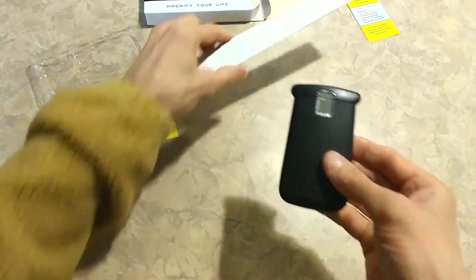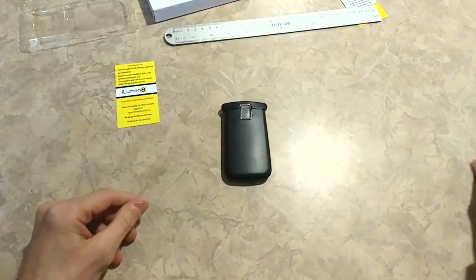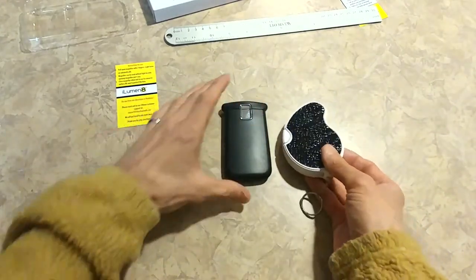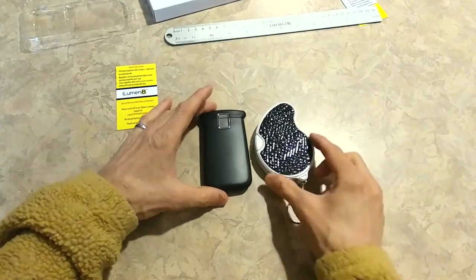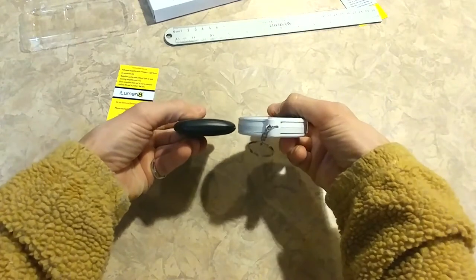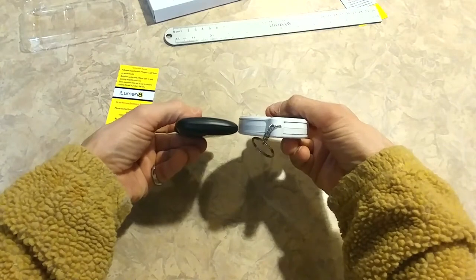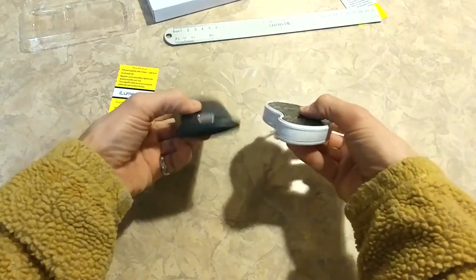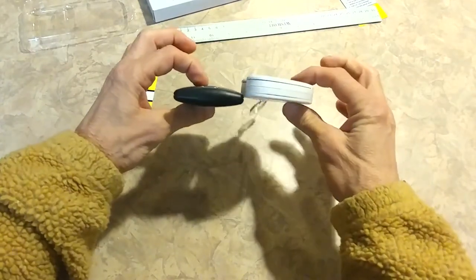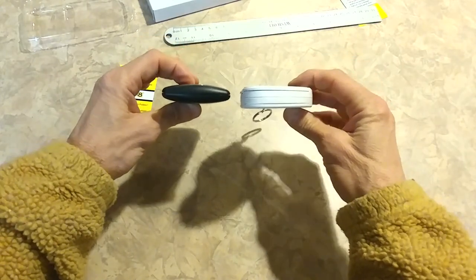There are a lot of magnifiers claimed to be pocket size. Here's one from a company called Fancy — they call this a pocket magnifier. If you look at it, it's a similar size. But look at the bulkiness of that compared to ours. Look how fat and square on the edges it is. It's just clunky and big and bulky.